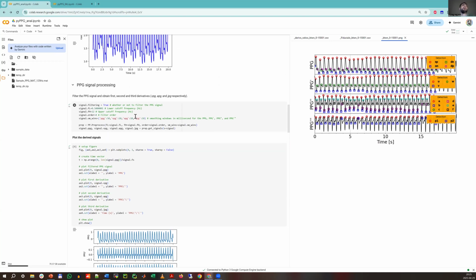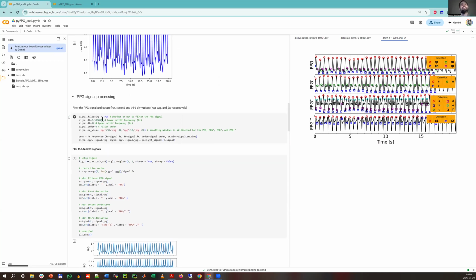I think what is more important is that we used an IIR filter, and what you see here is not an exact 0.5 cutoff frequency. It's because of stability.